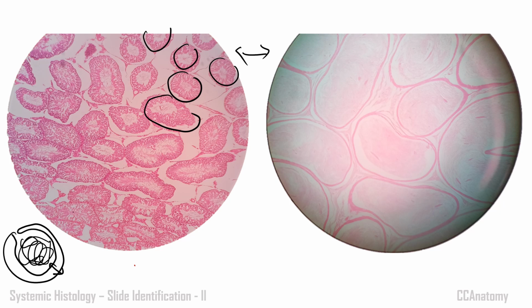So these two slides are the slides of testis and epididymis. In case of testis, these multiple cross sections are nothing but the seminiferous tubules, which contain Sertoli cells. Then multiple stages of the developing spermatozoa, spermatogonia, and spermatids, everything will be there. Because of that, these cells are mostly confined to the basement membrane. You can see this is the basement membrane, and the cells are arranged close to it, and in the lumen the spermatids will be there.